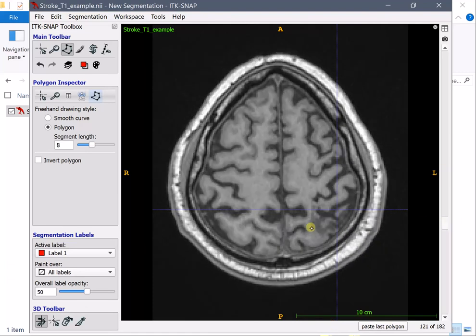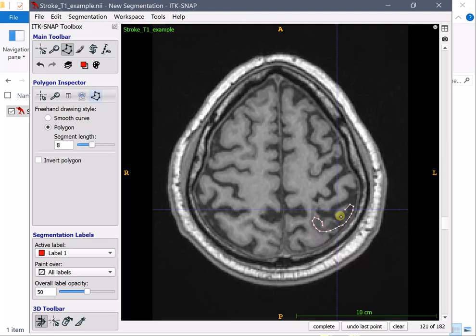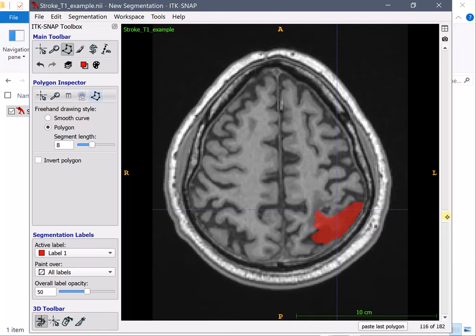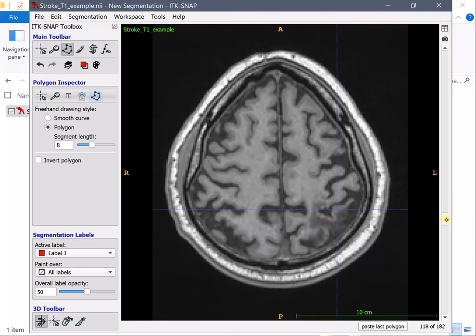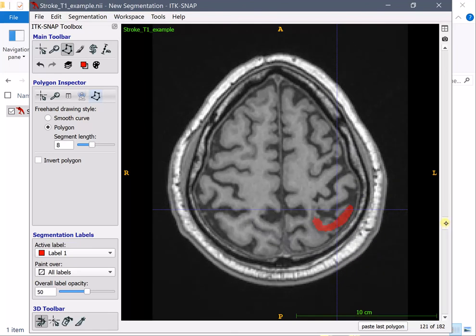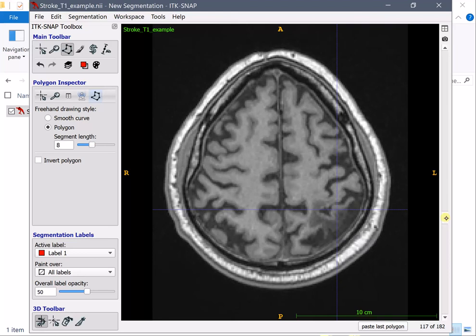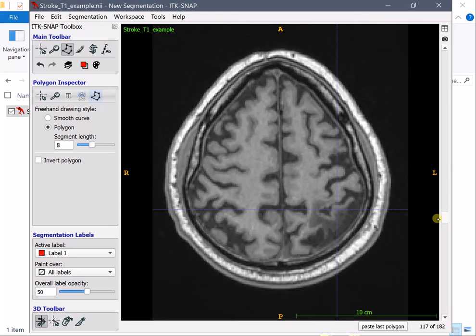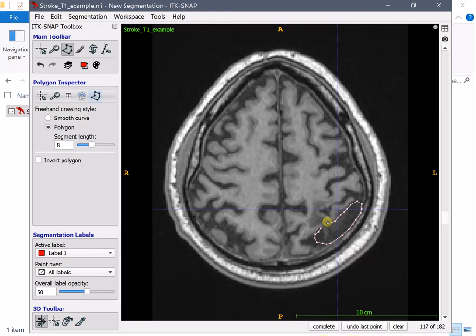Okay now we have still some lesion here. Normally I would be a little more careful in trying to avoid the sudden changes in shape you see this change in shape here and create something in the in between which is a shape that could accommodate both the upper one and the lower one.